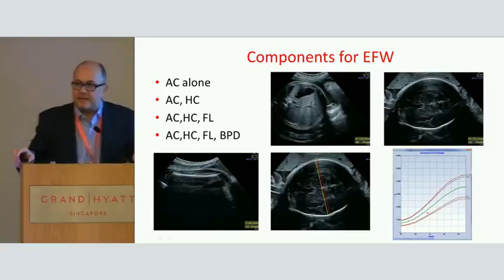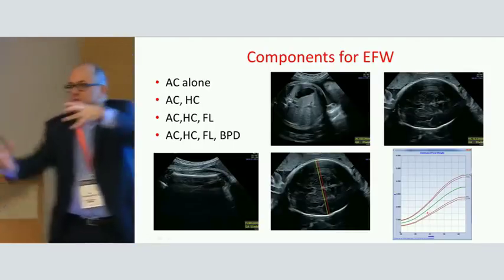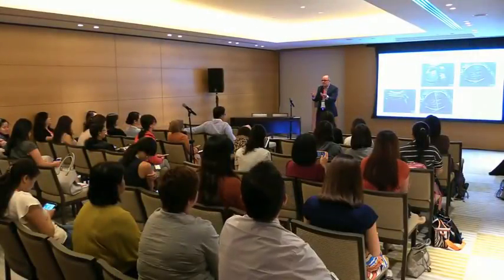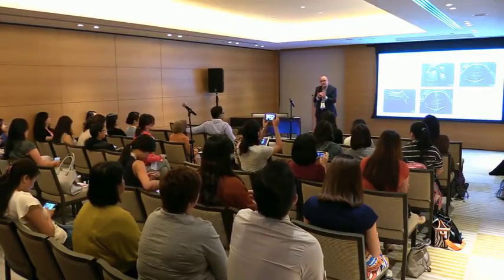Now, if I take you, sir, and I measure how tall you are, and I measure your head, and I measure your abdomen, I can kind of work out how much you weigh. But it's not going to be as accurate as if I put you on a weighing scale, right? Because I have to estimate your weight from the measurements that I'm taking. And we can do the same with the baby.